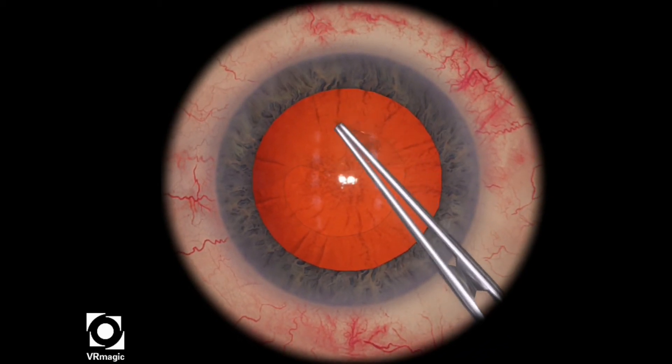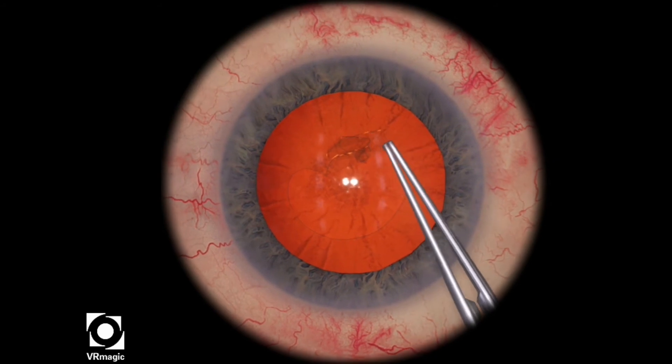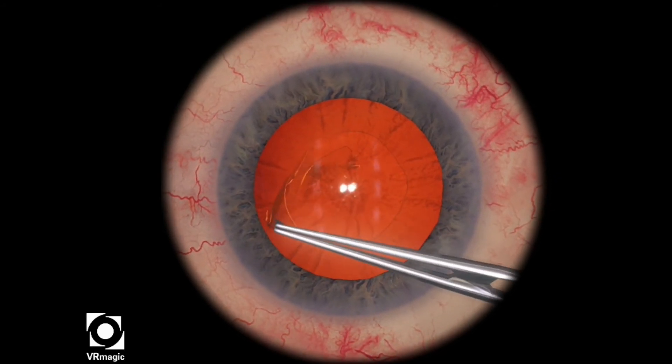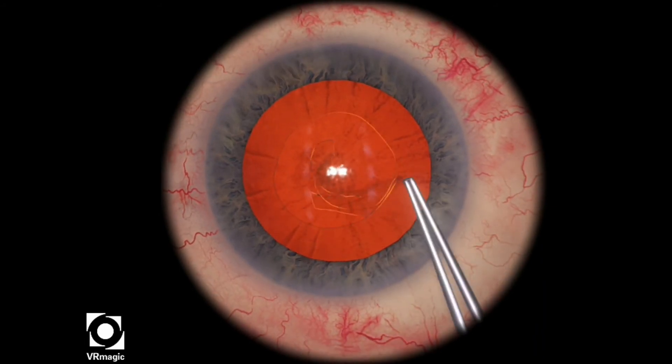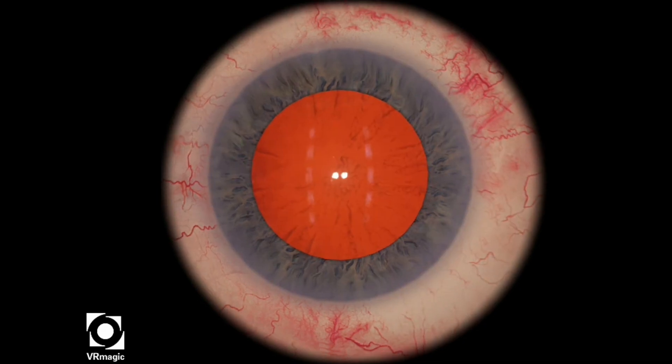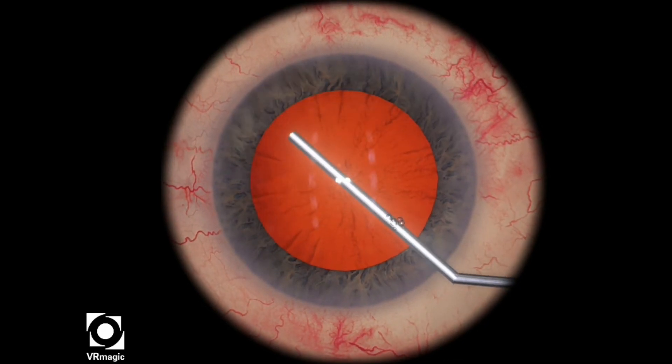Then I just continue on in the regular fashion, just like in the video with the guiding elements, and I want to trace and make it as round as possible. That looks okay — it's a little bit not as great in the two o'clock area, but we'll try it one more time.